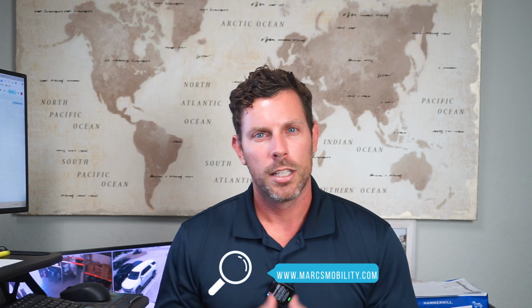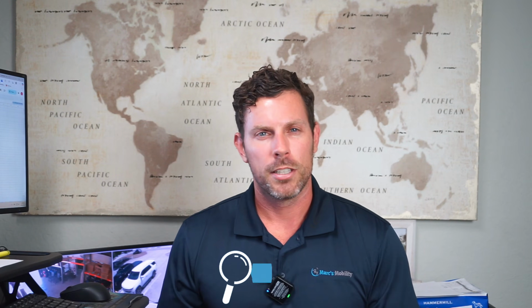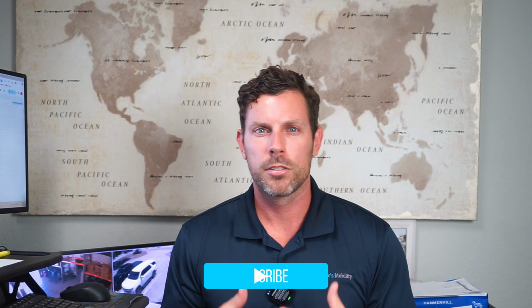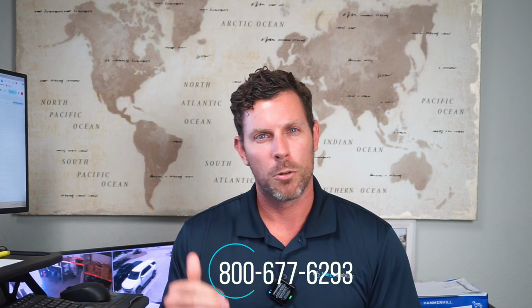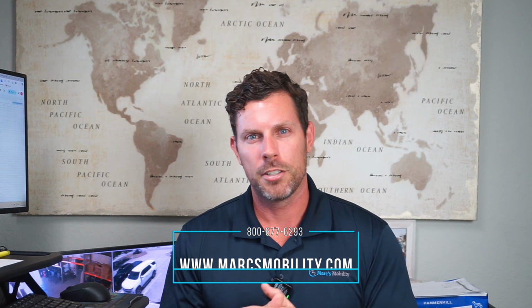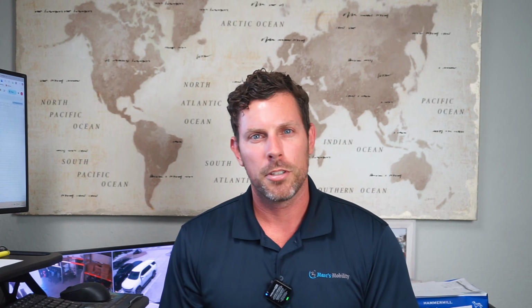Now, I do want to mention that everything we've shown you in this video, we currently sell gently used. Shortly, we will be able to offer these to you new as well. So you can go down and look at the links to find out more information on these products, or just give us a call, because we'd love to speak to you about the questions we went through: your height and your weight, where you're going to use it, and we'll be able to best identify the best drive configuration for you. If you have any questions, give us a call at the number below. We'd be glad to speak with you.